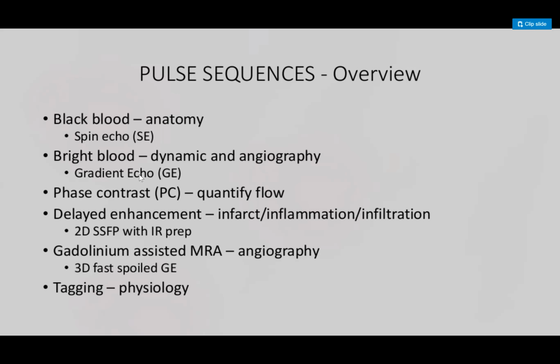And then I was talking about velocity encoding, where you can actually measure the velocity. We call that phase contrast imaging. That's the name, phase contrast. It's like Doppler. Then we also talked about the imaging after the contrast, which is what we call delayed enhancement imaging.